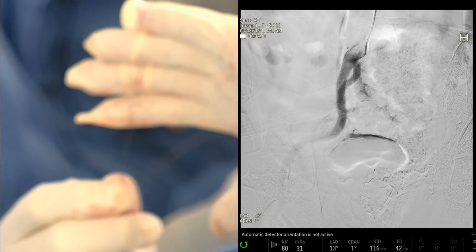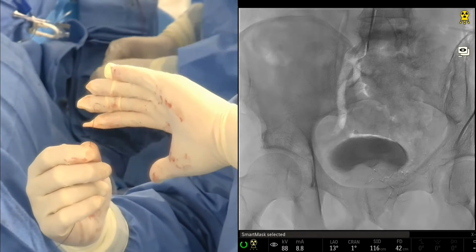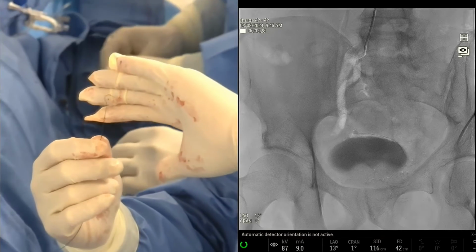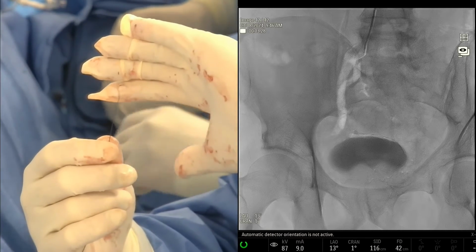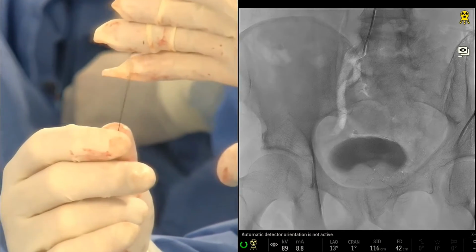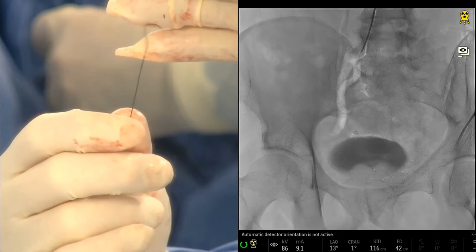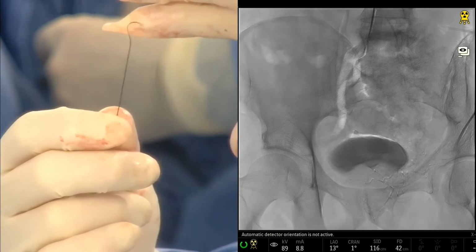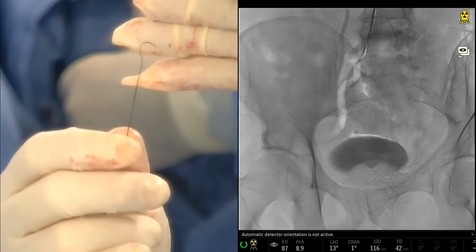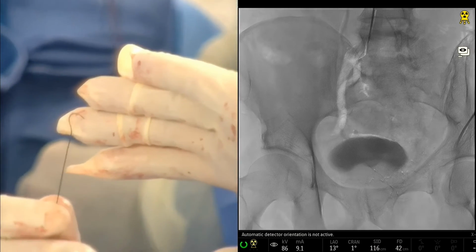Can you guys see the shape of this wire here? So everybody that works with me knows that this is my favorite shape. It's not as dramatic as it sometimes is, but I call this the question mark. And I think for prostate embolization, giving a little back curve on the wire along with the tip curve gives us the best chance, specifically if you're not using an angled microcatheter, to get into those really angulated type 1 vessels. And so that's the curve that we use.